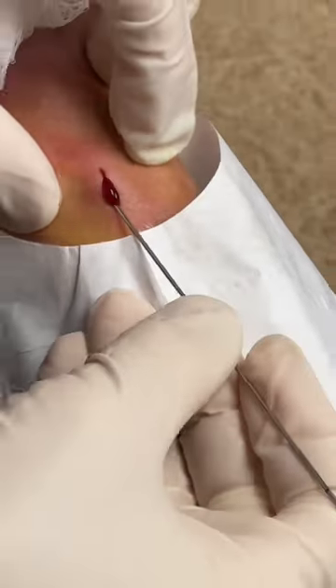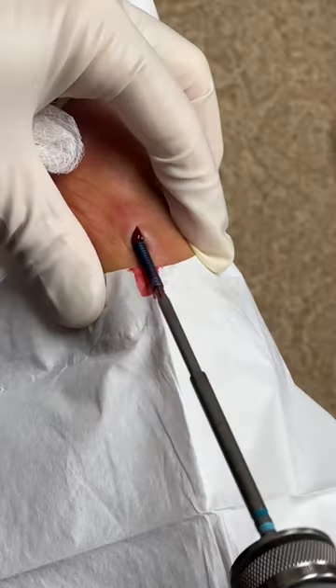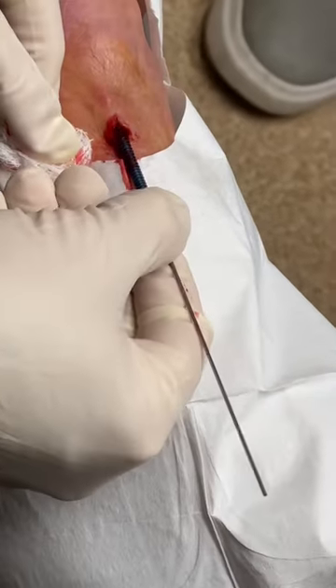So the next step is to insert a wire into this screw because the screw is cannulated — it actually has a hole in it. We're feeding a wire down into the screw, then we insert the screwdriver and back the screw out.